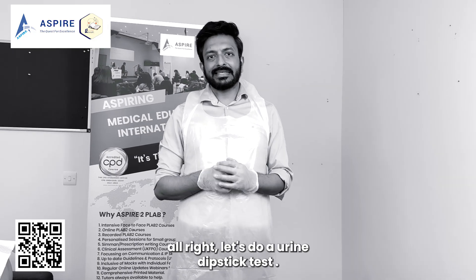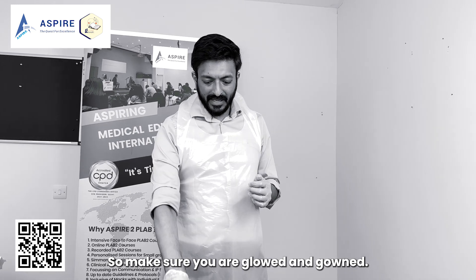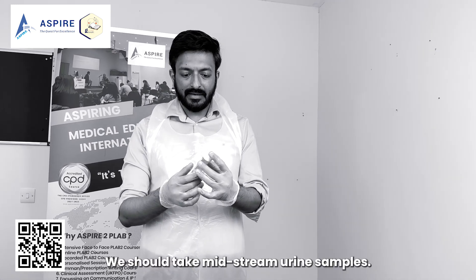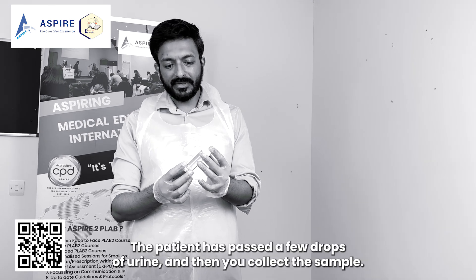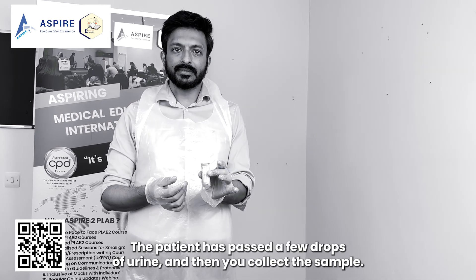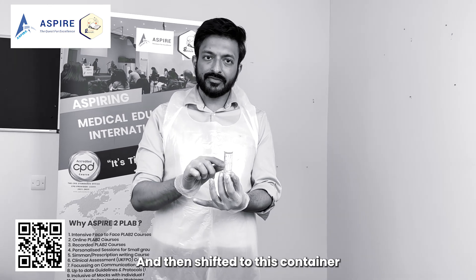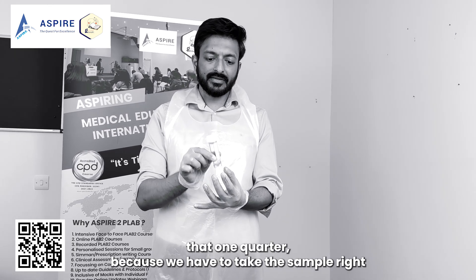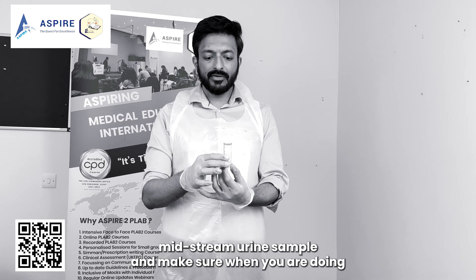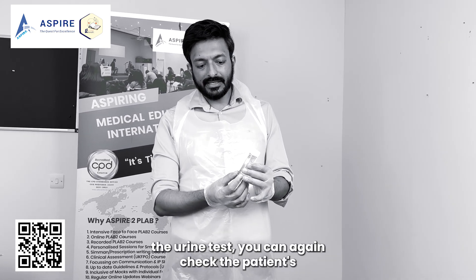Let's do a urine dipstick test. First, make sure you are gloved and gowned. We have to get the urine sample — we should take a midstream urine sample. The patient passes a few drops of urine first, and then you collect the sample. Sometimes they might ask if you can collect in another container and shift it — that won't work, because you have to take it right midstream.